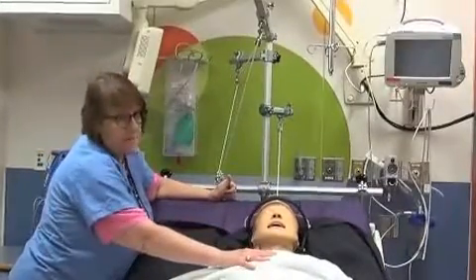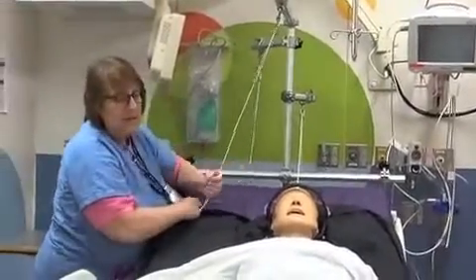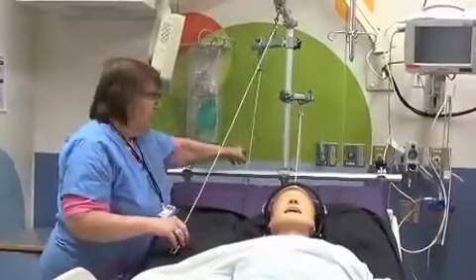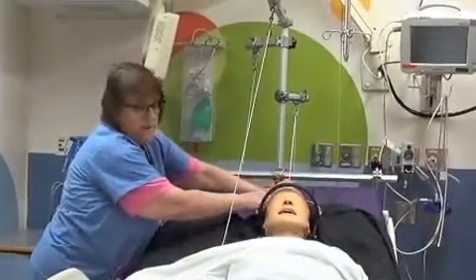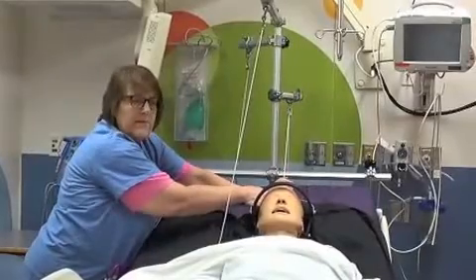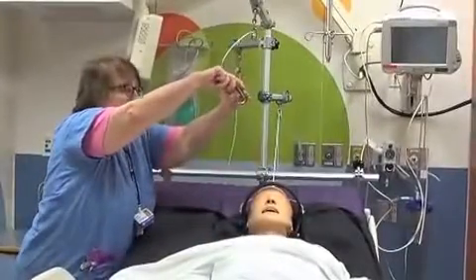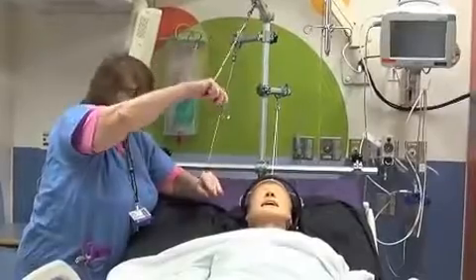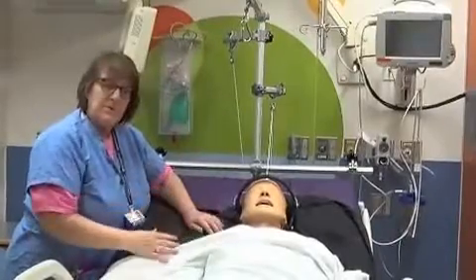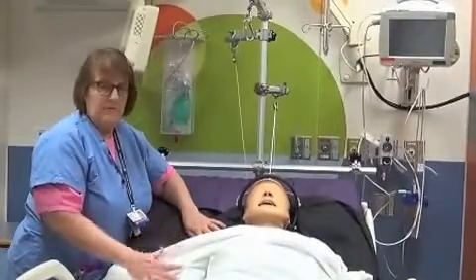When they're sitting straight up — I'm not going to set him up, you'll have to use your imagination — they can sit up unassisted. This way they can still remain in traction and they can eat and play when sitting up. All you do is unhook from the halo, give some traction to help them hold their head as they're sitting up, and once they're sitting up you just clip straight into the clip that's on the halo. They don't have to be supported with the bed, but if it's a child that needs support you can do it that way. They sit up unattended — they can play, move around, and remain in traction in the bed.